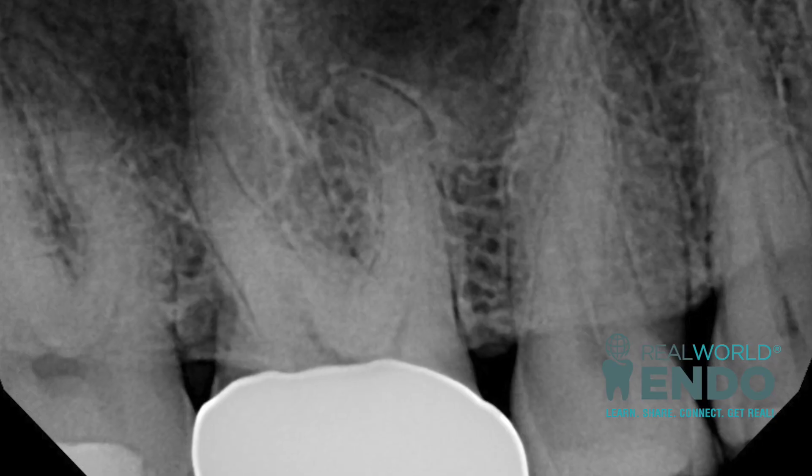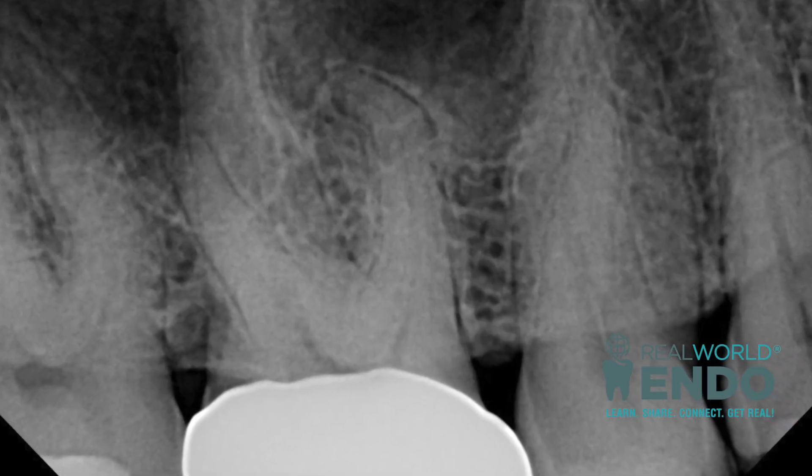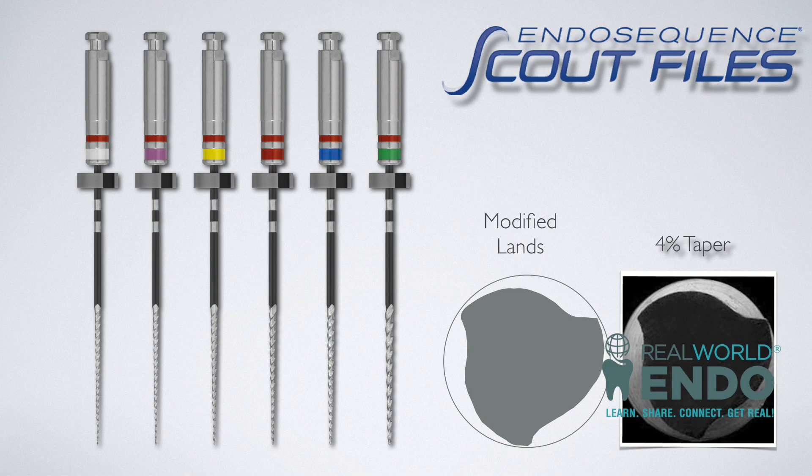Hey folks, just finished up at work and I had an interesting case. I wanted to share a couple of clips on this quick tutorial on bending EndoSequence Scout files.